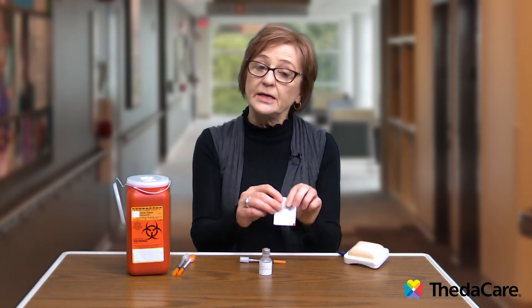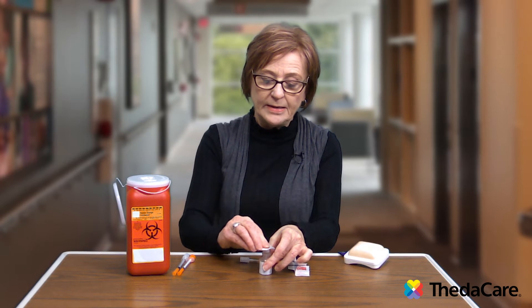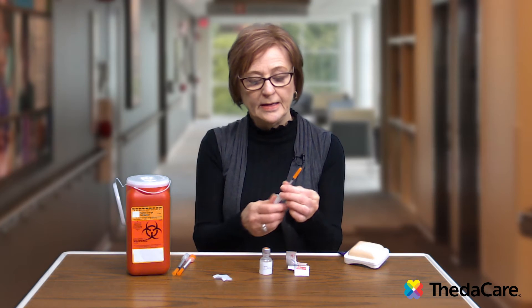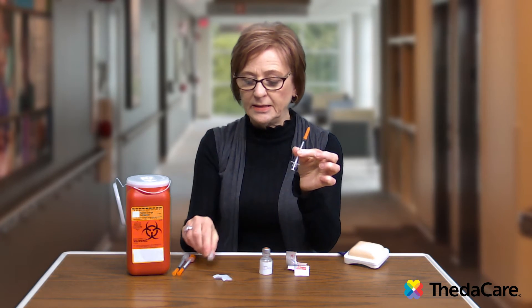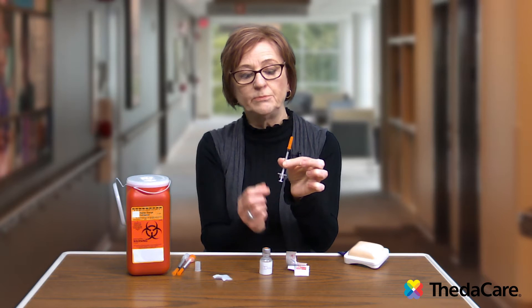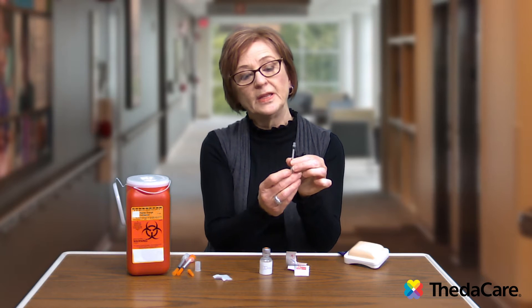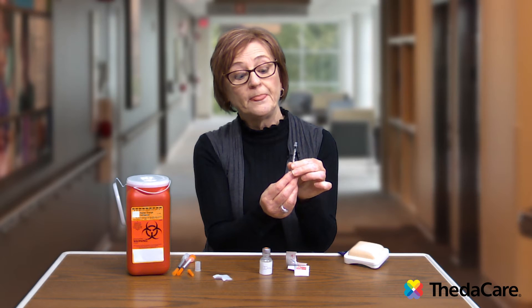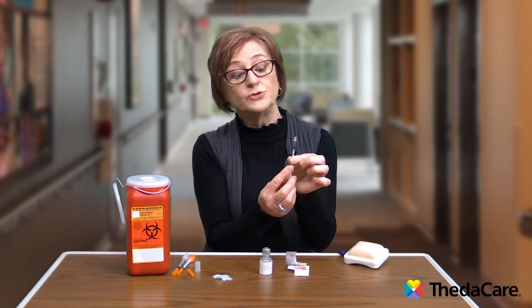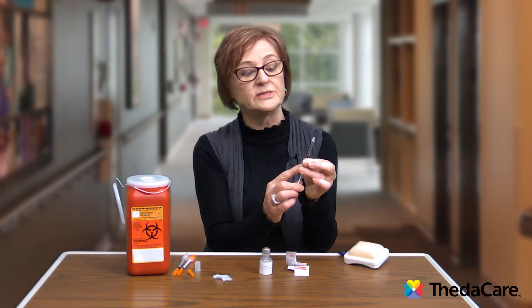Take the alcohol swab and wipe off the top of the bottle. Remove both caps on the syringe — the back cap that covers the plunger and the top cap that covers the needle. Your next step, and a very important one, is to draw up air into the syringe that matches the amount of insulin that you're going to take.